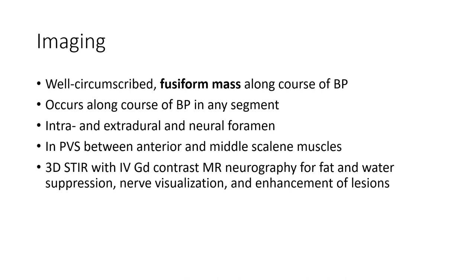3D imaging with IV gadolinium contrast MR neurography using fat and water suppression allows nerve visualization and enhancement of the lesion.